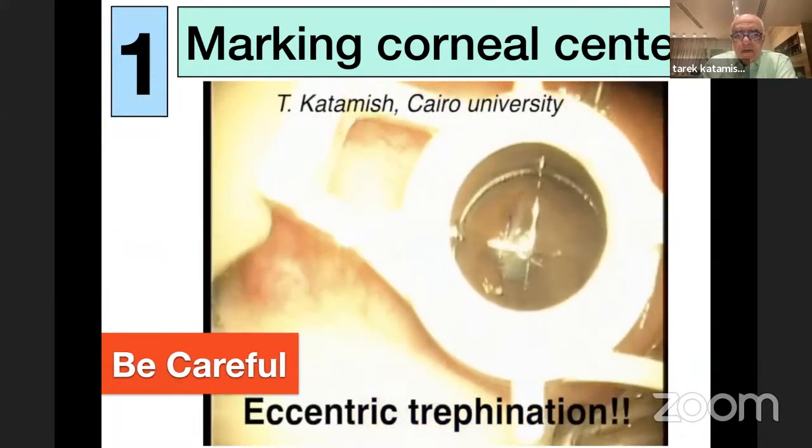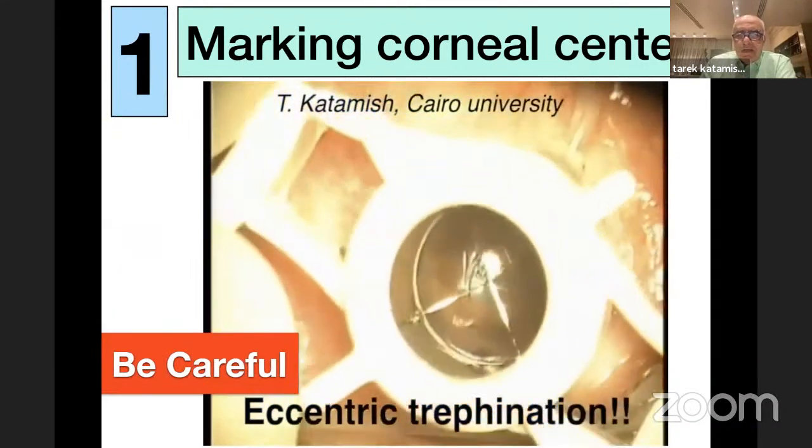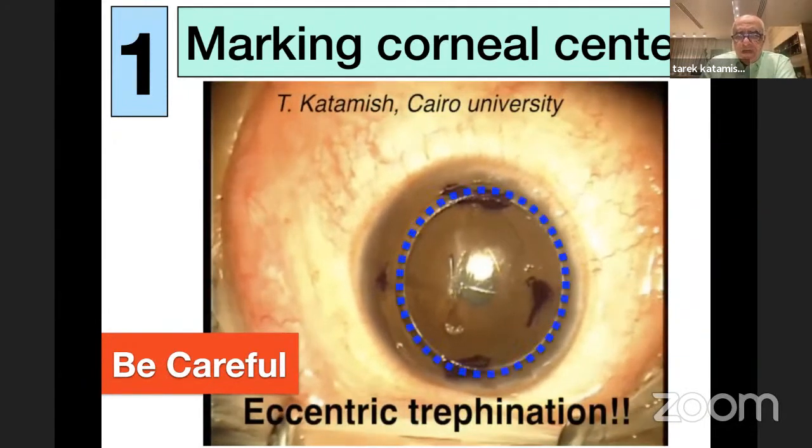But be careful. Sometimes if you are not meticulous in detecting your corneal center, you may have an eccentric trephination like in this situation. So you have to spend some time and some minutes for perfect centration of the corneal trephination.